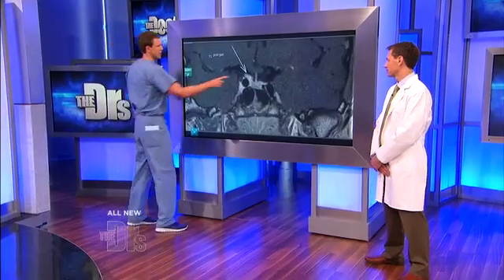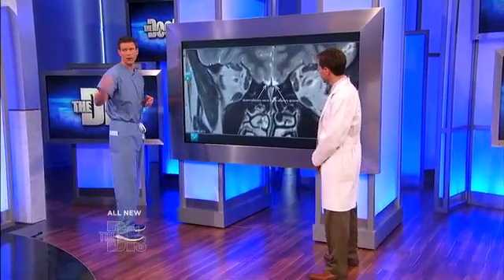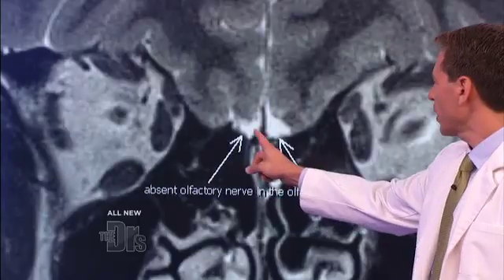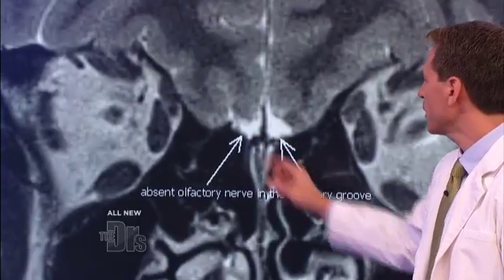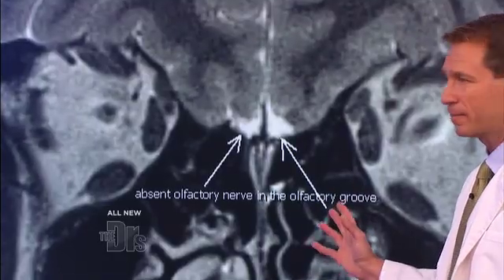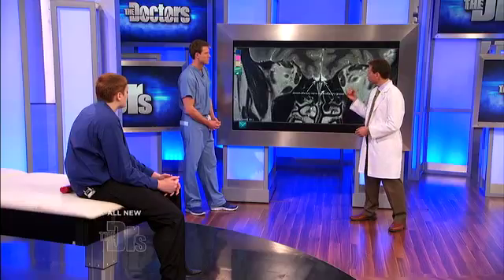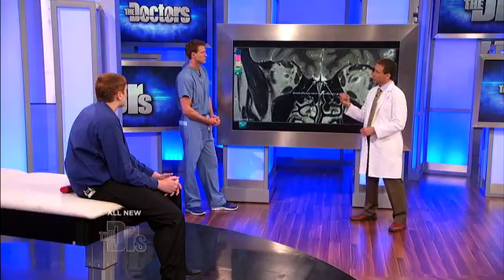Now, Dr. Spitz, a couple of other things I want to look at — because we mentioned before, Brandon, you lack a sense of smell, and this image from the MRI shows potentially why. These bright areas right here should be the nerves for the sense of smell, and they're gone. There should be a darker signal there. The nerves for the sense of smell, when they form, also bring along the nerves that stimulate the pituitary gland to release those key hormones for puberty and sexual development. Since those nerves for the sense of smell are gone, those nerves that control the pituitary are gone — and that's why Brandon has this syndrome.